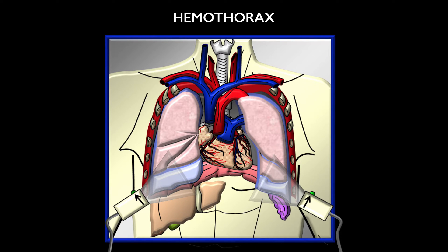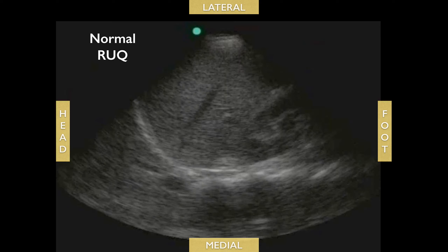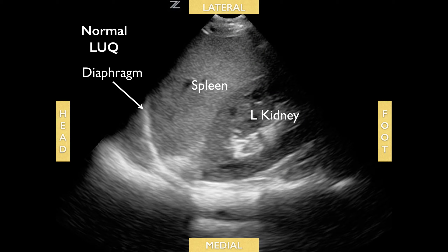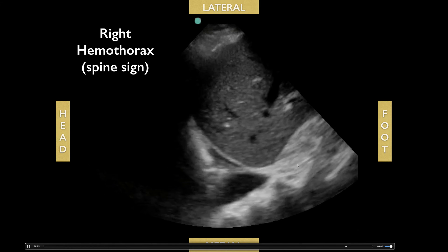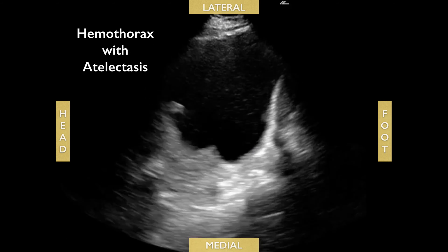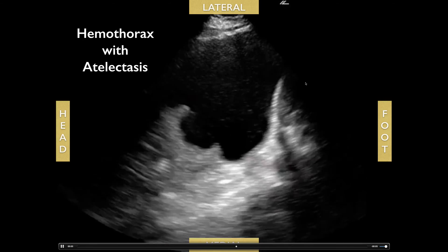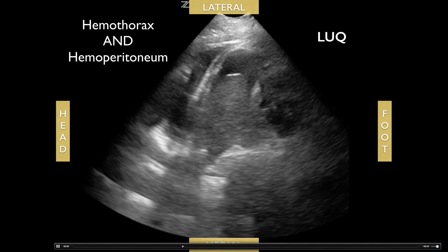While performing the left upper quadrant and right upper quadrant views, you also want to rule out hemothorax. Just look right above the diaphragm in the lung space. In a right upper quadrant view, look above the diaphragm for free fluid. In a left upper quadrant view, look above the left diaphragm. Here's a patient with a right hemothorax — note the spine sign, with the spine visible past the diaphragm, and an anechoic area indicating fluid in the chest. You can also see a patient with both hemothorax and perisplenic fluid.